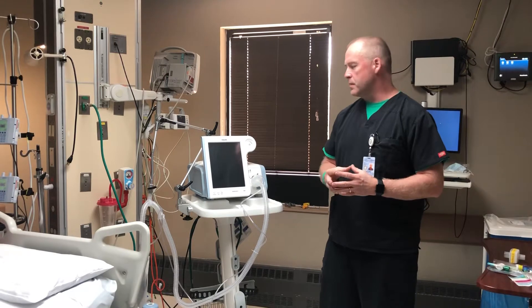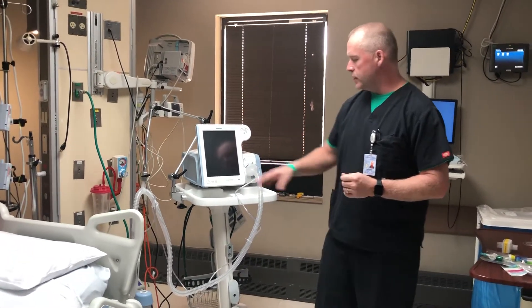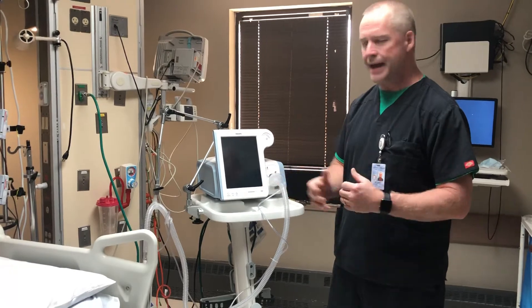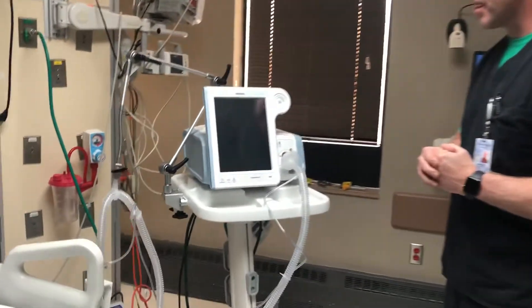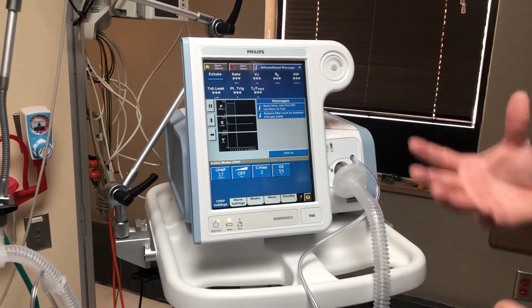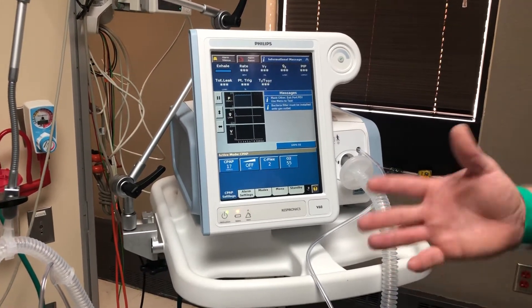For today's purposes of demonstration, we're going to set it up as a pressure control ventilator. Here we've already had the oxygen hooked up and already plugged into the red receptacle outlet. We're going to turn it on and we'll go through this quick check. It automatically comes on basically whatever was set up last — for this demonstration, we already had it set up as a CPAP.